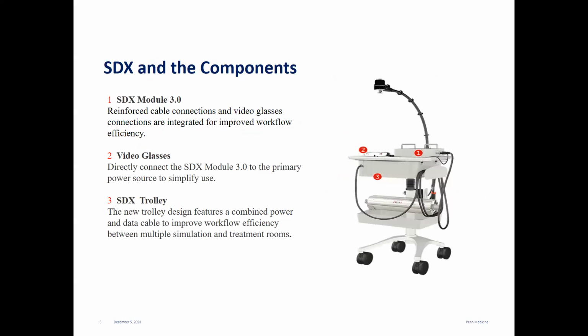So this slide demonstrates the SDX and all of its components. The device labeled 1 on the screen is the SDX module. It comes with reinforced cable connections, and the connections to the video glasses are integrated for an improved and more efficient workflow, which helps a lot when moving around to different machines and from sim to the treatment room. The device labeled 2 are the video glasses, and they directly connect to the SDX module, which also simplifies the use.